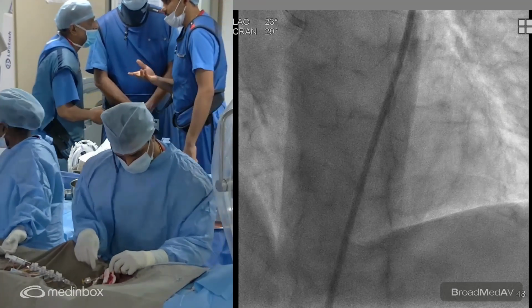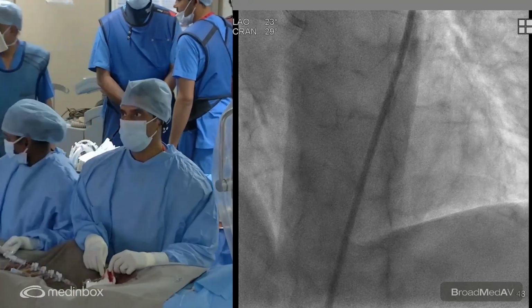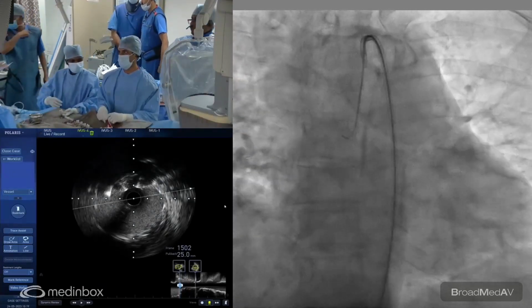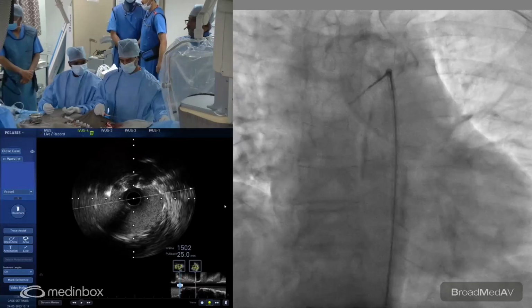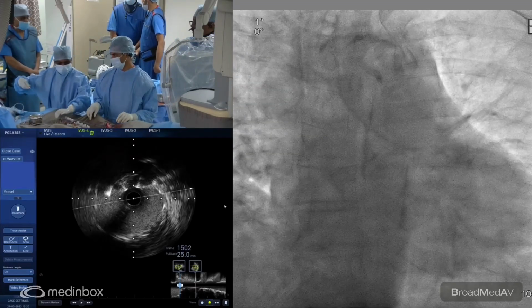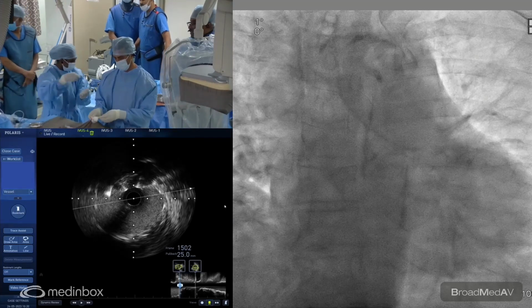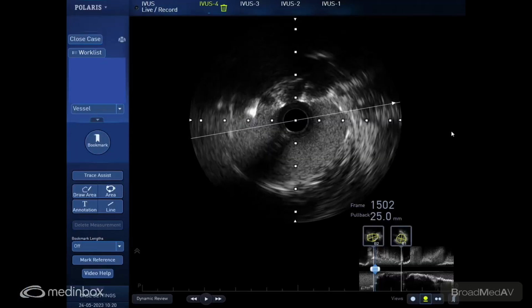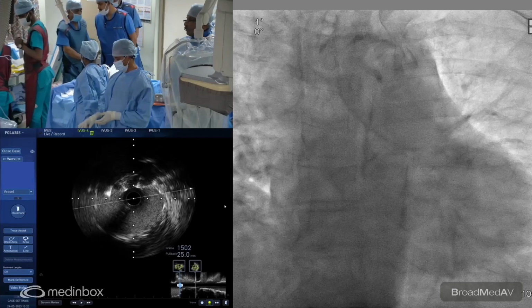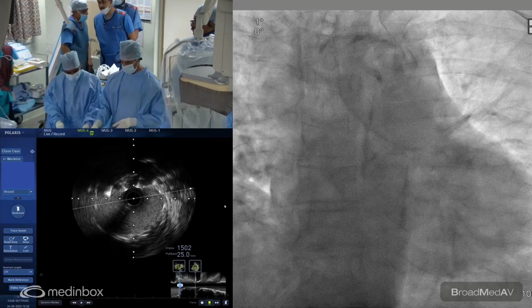We then used a 3.5 IVL balloon to debulk the lesion. We took three shocks of 10, and then we saw that the balloon had expanded well after that. Obviously, we didn't see obvious cuts, which is not often seen with IVL. The IVL just softens the lesion, but you could see the balloon nicely expand after the IVL was delivered.